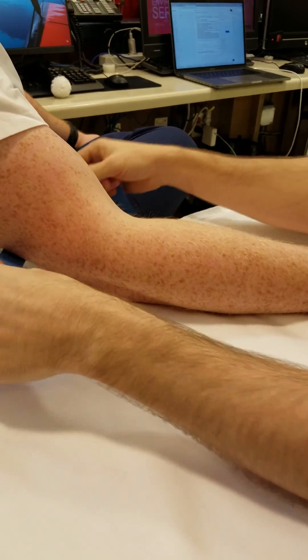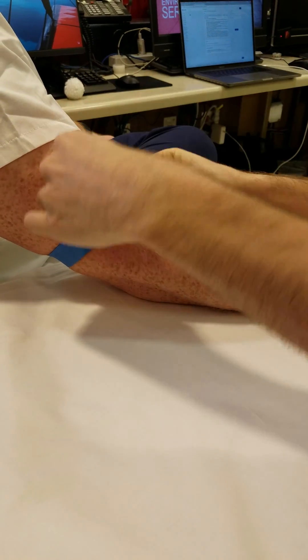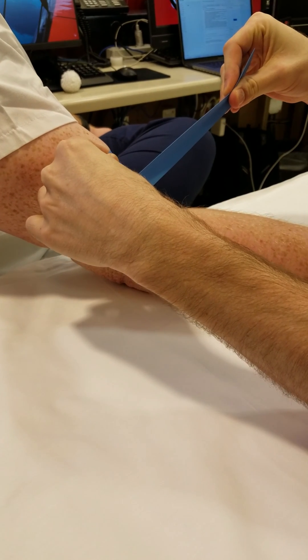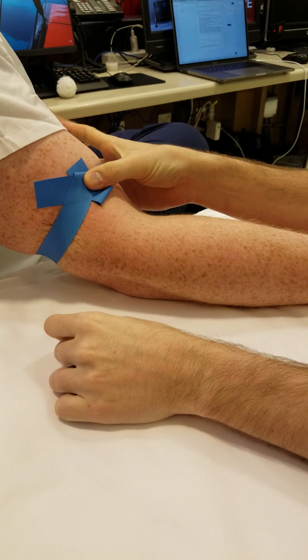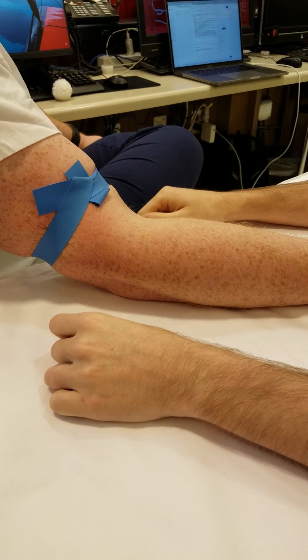Hold it flat, wrap it around the arm, make sure there's no pinch points, pull two inches away from the point where they meet, push it through the top, and let go. And there you have it — the correct way to place a tourniquet.